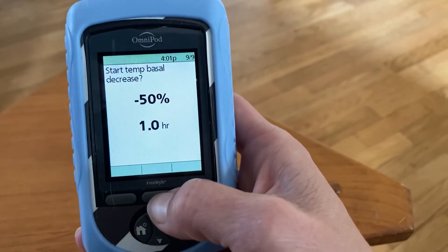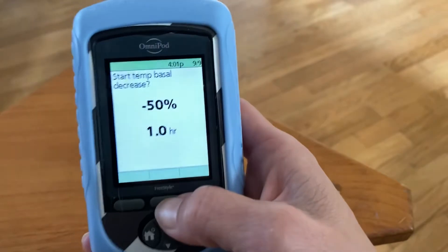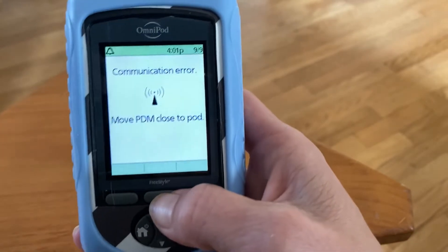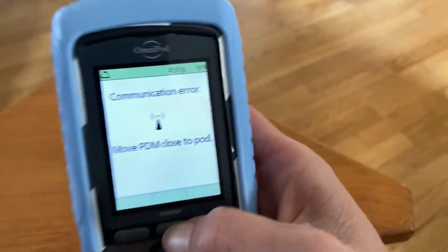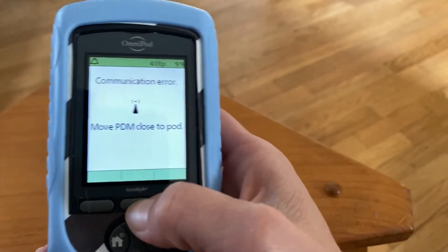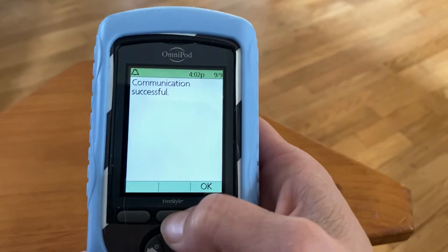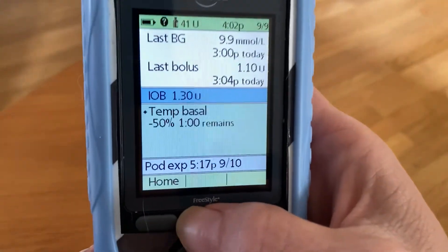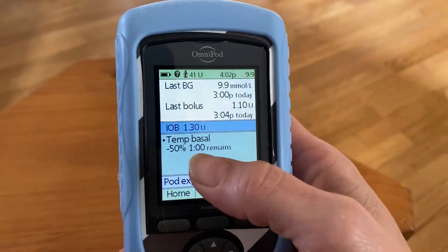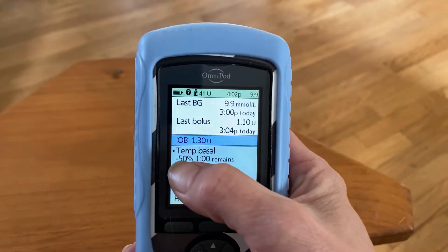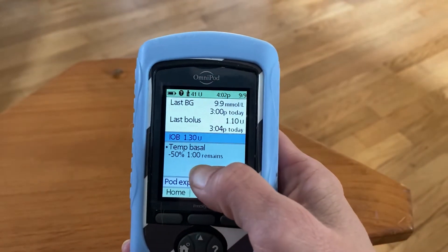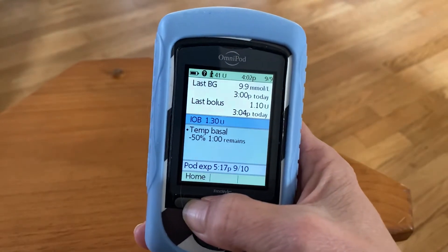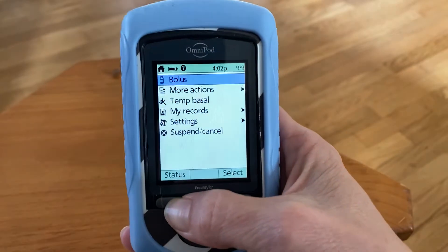In this demo, she's too far away so it's not going to be able to deliver that to her — it's going to say communication error. But if she was next to me and received the insulin, I would make sure it was delivered. In the status screen it's going to say temp basal decrease. She might have gotten that because she just walked by, so I'm going to cancel it.